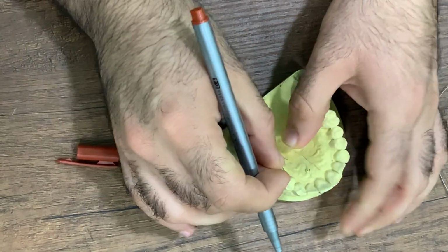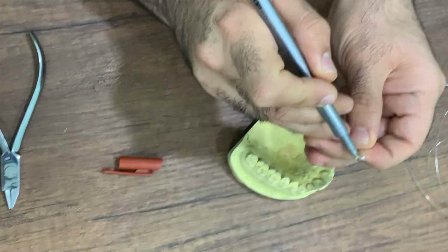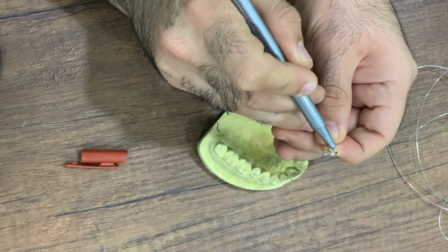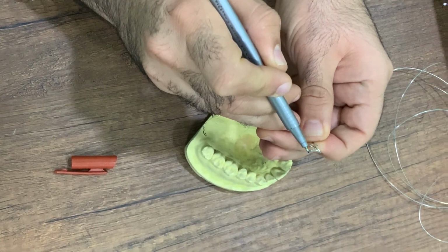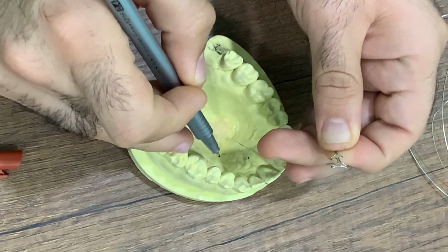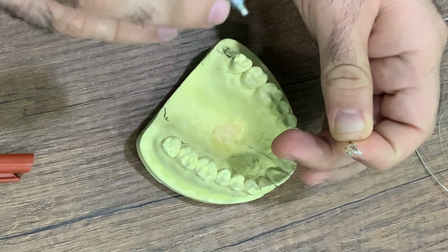To fit well on the convex lingual surface of the tooth to be moved. Mesially and distally, it continues as two small U loops. The width of the horizontal arm with U loops should be equal to the width of the lingual surface of the tooth to be moved.